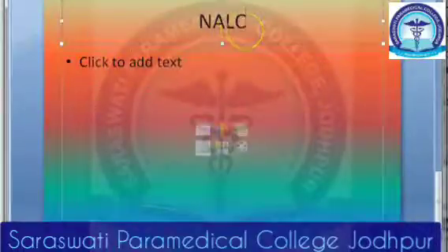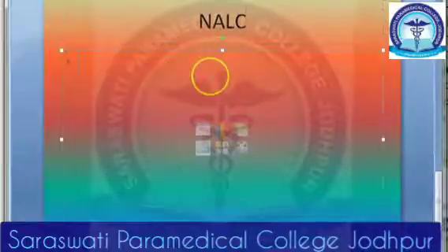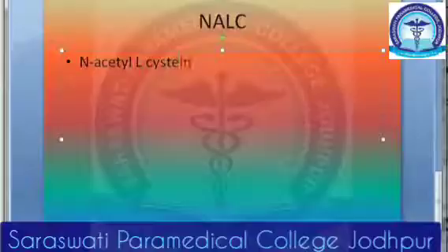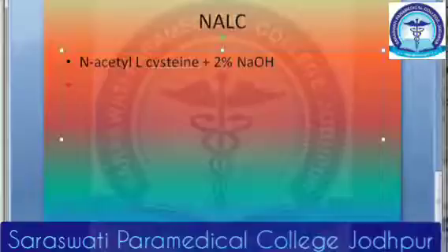Next method is the NaLC method. It's an option. You can either do Petrov or NaLC. NaLC is N-acetyl L-cysteine plus 2% NaOH. Here the NaOH percentage, you see it's 2%.